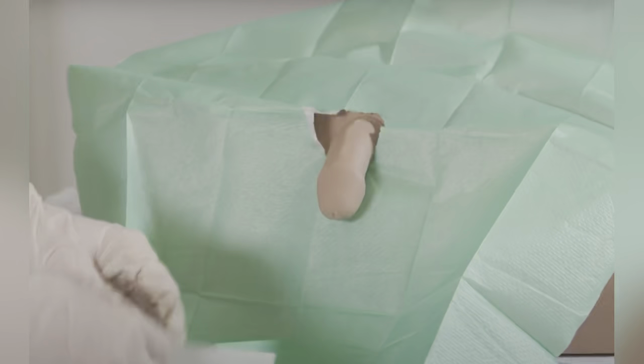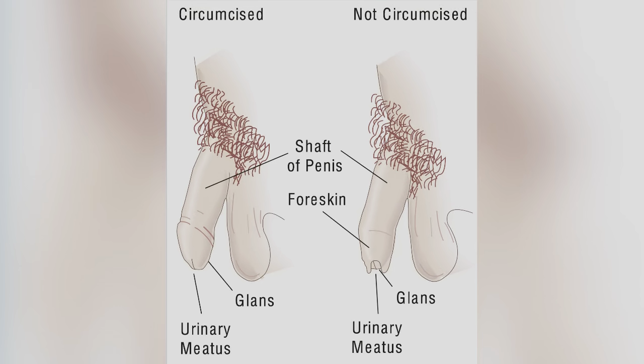Before you clean the patient's genitals, always place a drape which exposes the patient's genitals. This will make it easier for you to clean them. If your patient is male, then you need to clean the patient's genitals from the glans penis in the direction of the shaft of the penis. If your patient is not circumcised, then you need to pull back the foreskin to expose the glans.